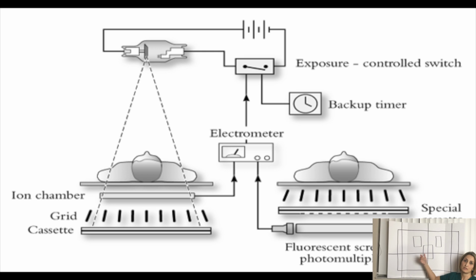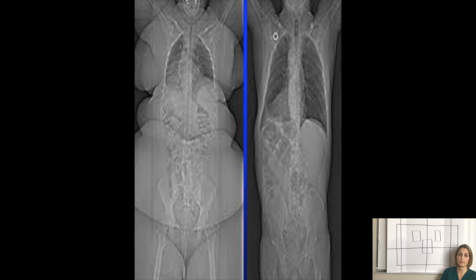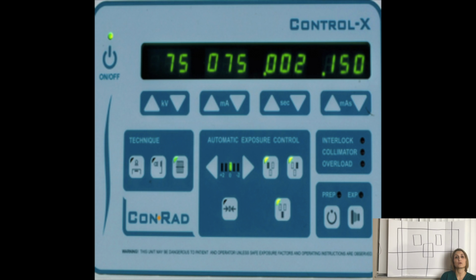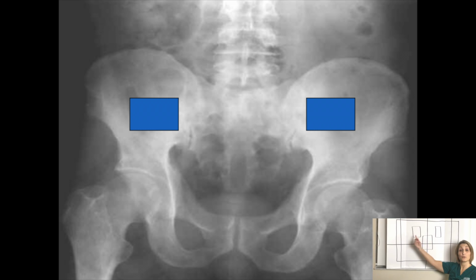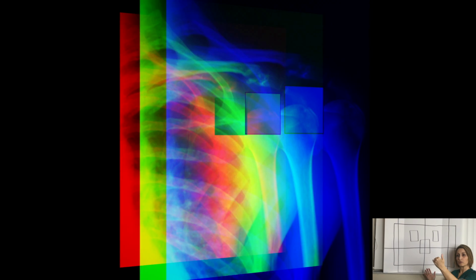The left and right chambers are also placed away from the mediastinum and completely within the lobes of the lungs on a chest X-ray. All AEC devices allow adjustment to the amount of radiation necessary to send the exposure termination signal. These controls regulate the IR exposure but often have different labels. AEC control labels are -3, -2, -1, 0, 1, 2, and 3. Most labels use the center control as the normal density. In this case, it will be 0, and allow both density to increase or decrease.